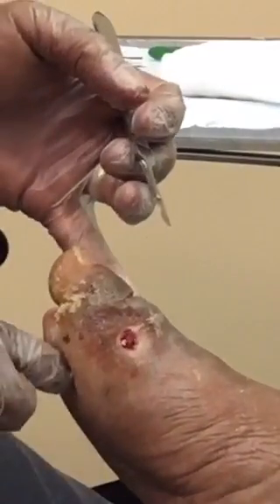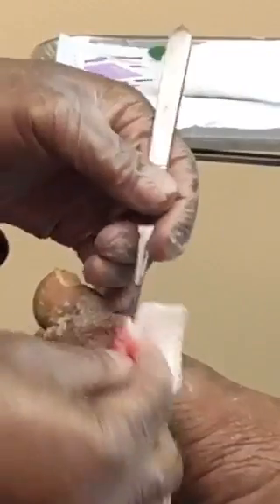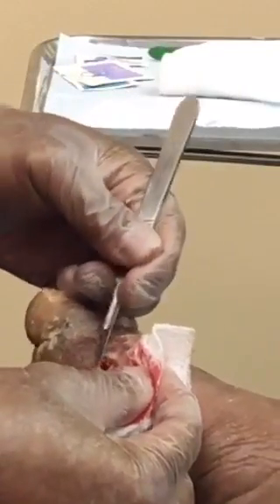Now you can see how much different the wound looks than when we first started. This is what you call a good wound bed preparation.